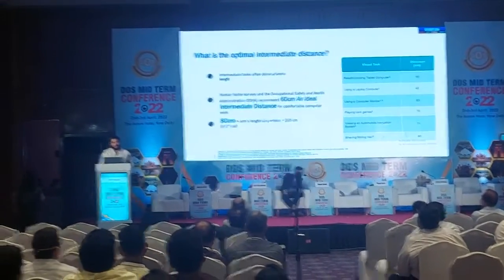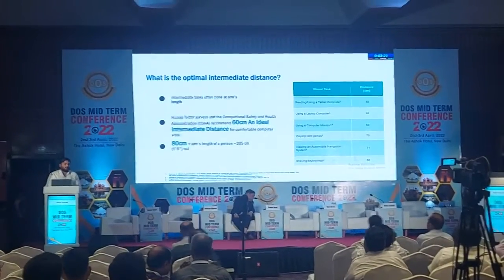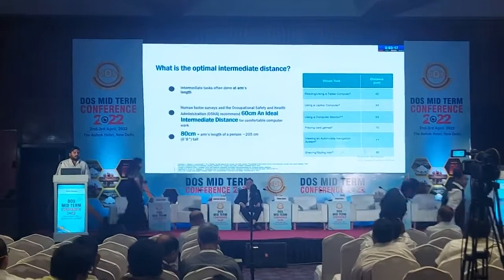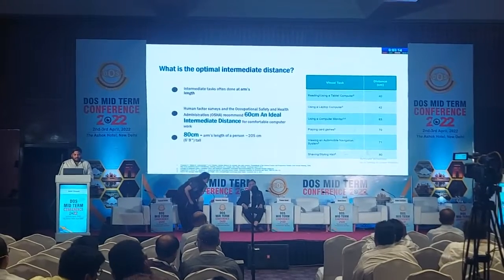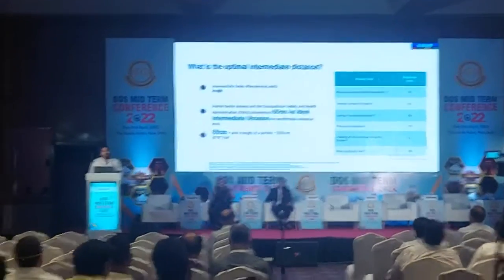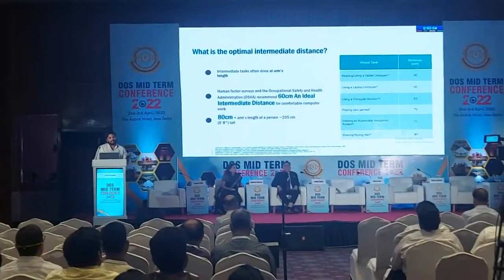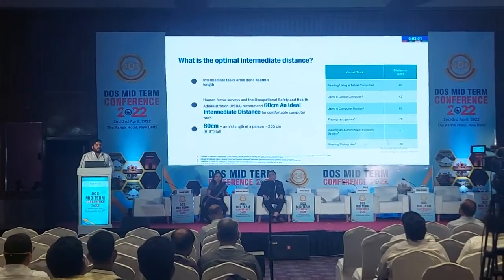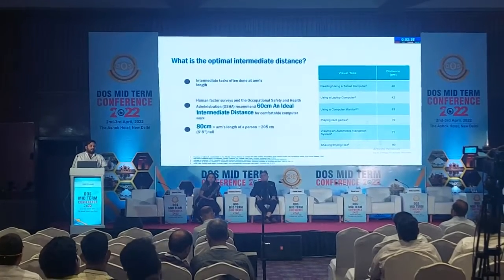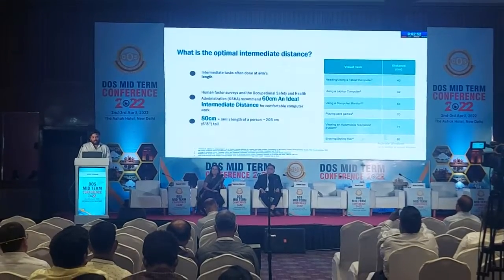Now, one of the very important questions these days that we are dealing with is what is an ideal optimal intermediate distance. Intermediate has become a very important aspect of today's life, wherein people are working from home. The majority of people are on a laptop or desktop. It needs to be considered. Intermediate is something which has come in a big way. I feel that we should also assess our patients clinically for their intermediate distance, even in our clinics, just like we do it for near. There are calibrated charts available for that, which are kept at 65 centimeter distance. So this is something I think we should start incorporating in our practice.